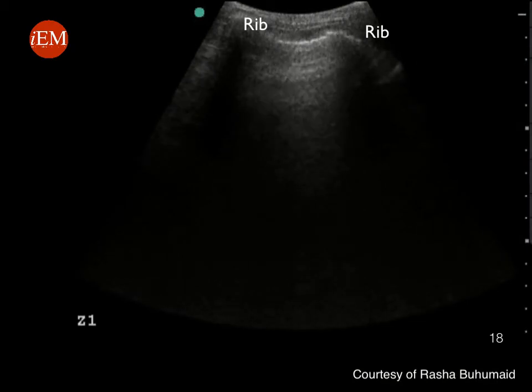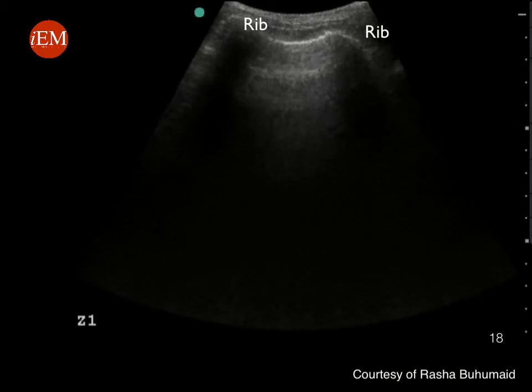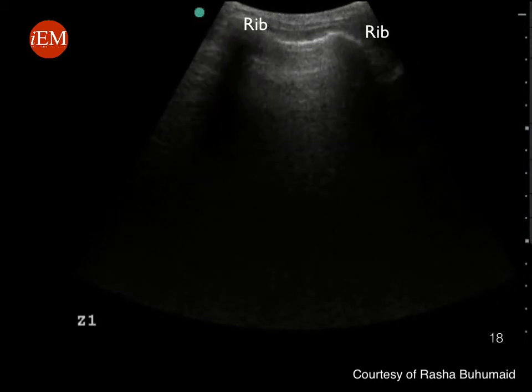Increase the depth to reach up to 18 centimeters to be able to evaluate the lung. This is a normal aerated lung. Note the two ribs that appear hyperechoic with posterior black shadowing, and the bright pleural line between the two ribs.